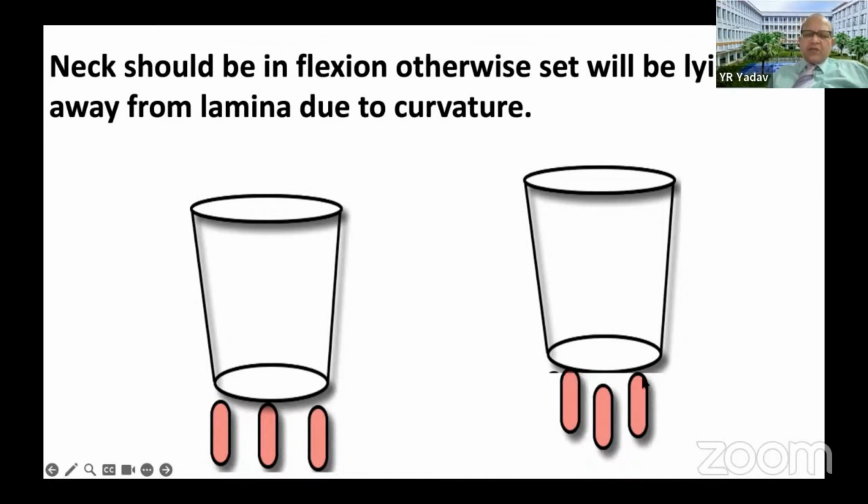One point: I have come across situations when I did not do sufficient flexion. If the patient has a lordotic cervical spine, then one spine is above, the other is also above, and the middle spine is way deep in the field. So there will be difficulty in doing surgery. It is better that you do a little bit of flexion at the cervical spine so that all the laminas are at the same level. So you can dock your tubular retractor very well and take out all three laminas using this tubular retractor in one position, with a little bit of cranial caudal angulation and movement.